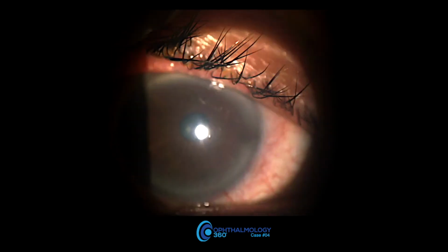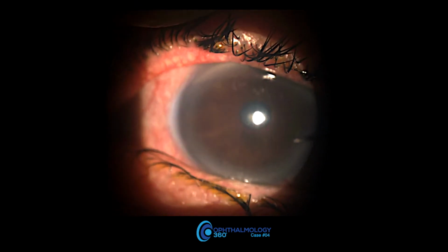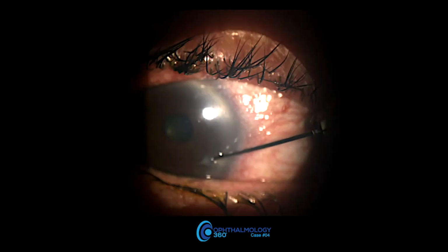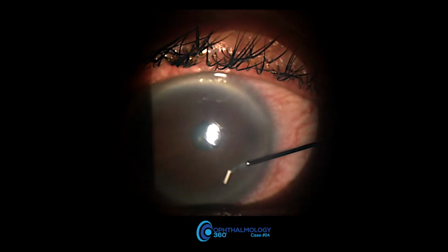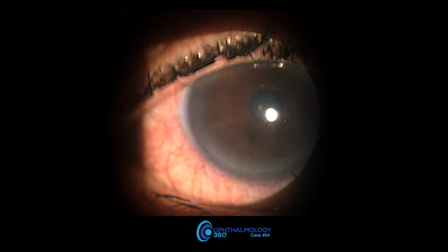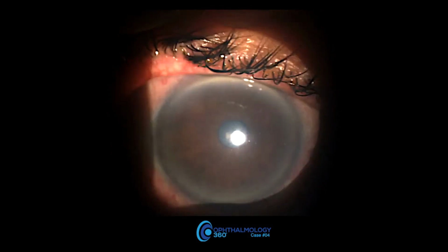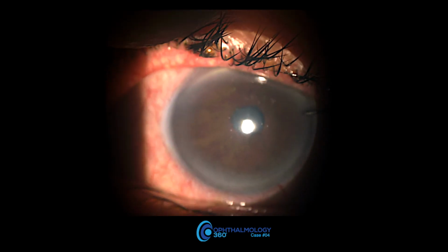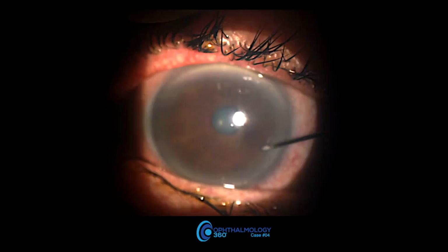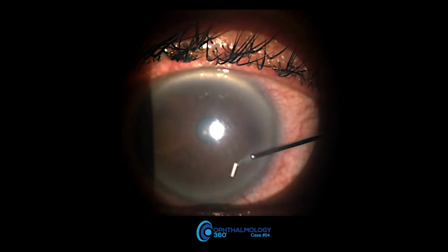And this one, I believe I did not even use, you can see I'm using counter pressure on the lid with my finger. And I have a pretty acute angle there, which I think is really preferable as far as insertion. You can't always get it that way, but you can see where no matter what you do, sometimes that implant is going to want to adhere.